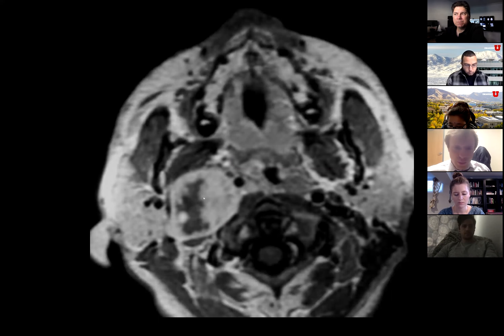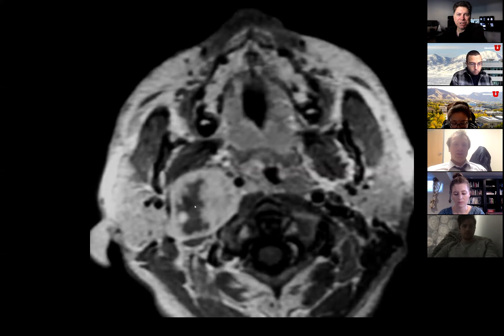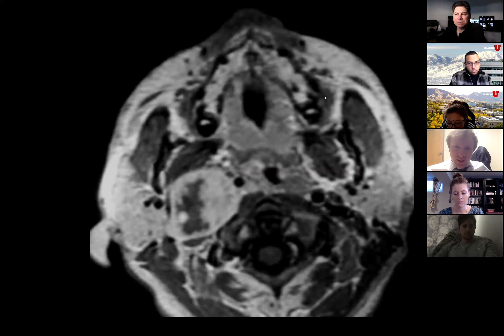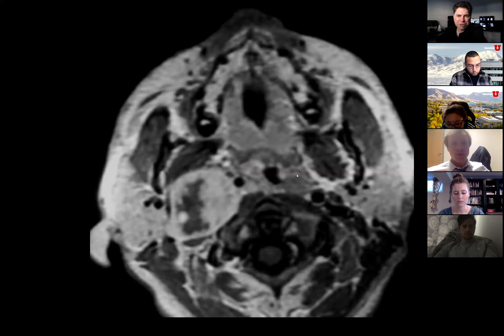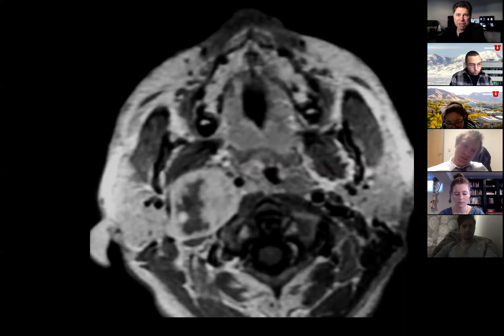This is post-contrast — this is enhancing and that's not. How do you know if you don't see the pre? You look at other things — the mucosa of the soft palate is enhancing and there's enhancement of the tonsils here. But it's always different if you only have one image; if you had the whole case, it would be easier to see.